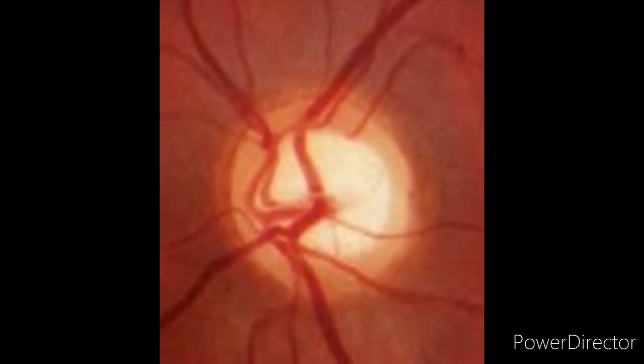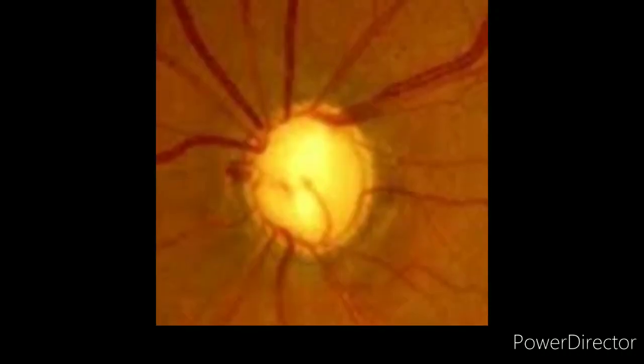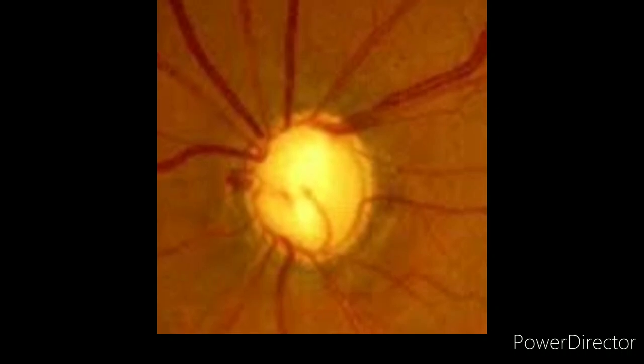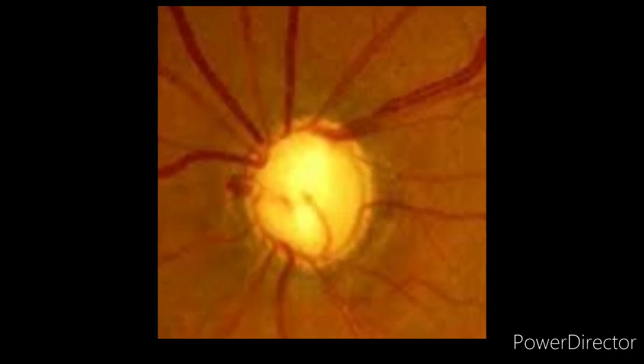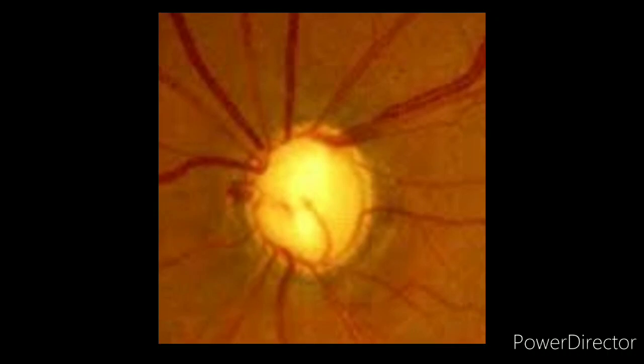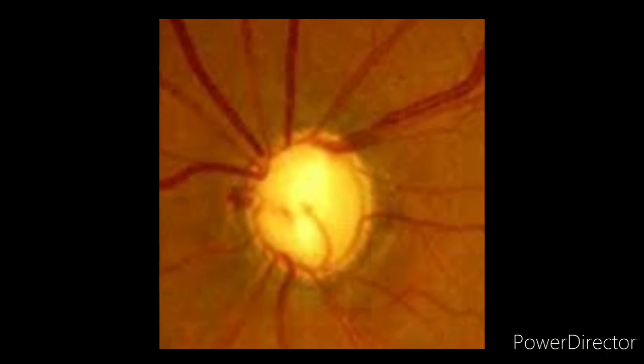And now there's the fourth patient with advanced cupping. You can see the disc is hollow in the center and there is just 0.1. If you divide the circle into 10, only 0.1 area has got the neuroretinal rim—0.9.